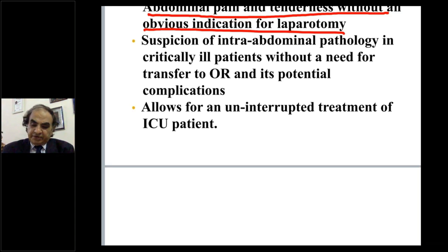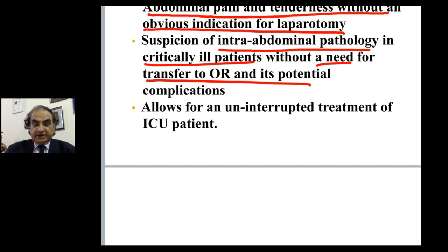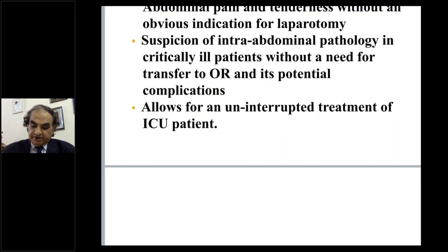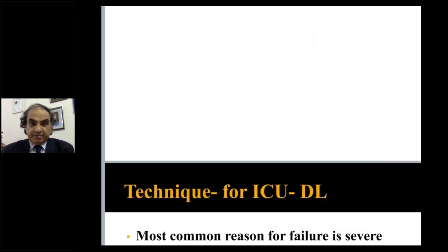If there is a suspicion of an intra-abdominal pathology in critically ill patients without a need for transfer to the OR, and you can do it bedside, it's an advantage. It allows for an uninterrupted treatment of an ICU patient. So you may do it uninterrupted. The patient doesn't have to go anywhere. Easier said than done. I'm giving those indications definitely with everything in my mind. The positives and the negatives, the do's and don'ts.